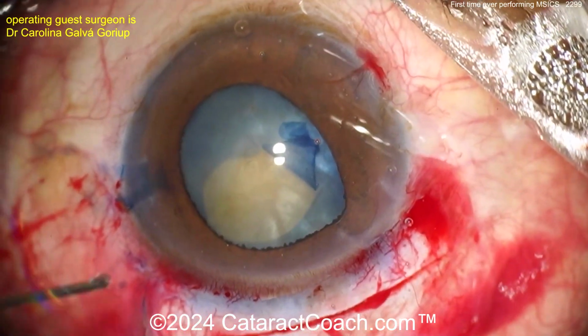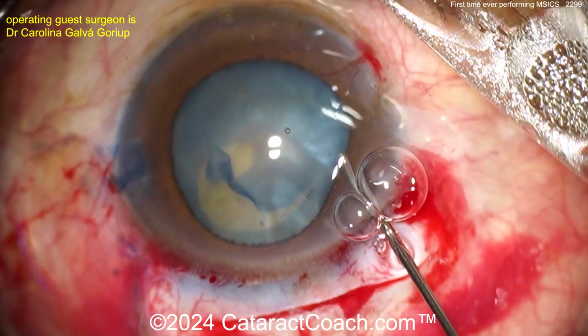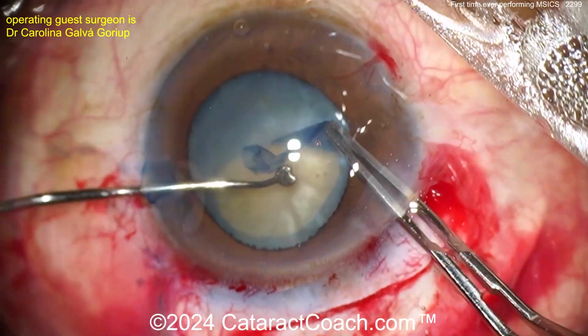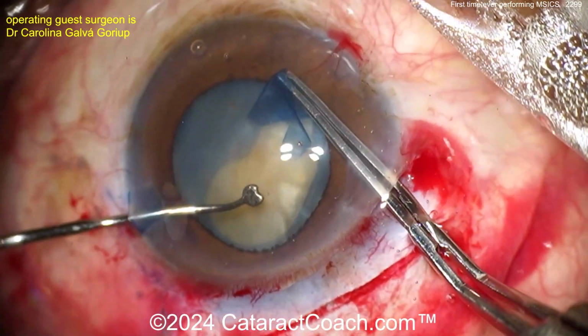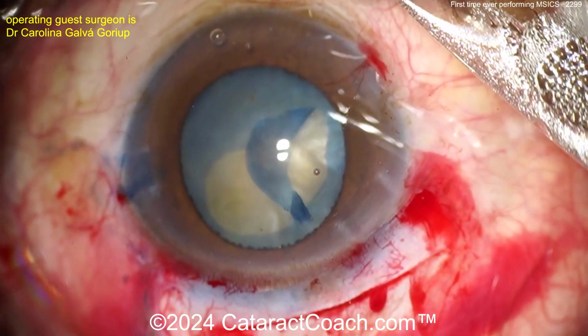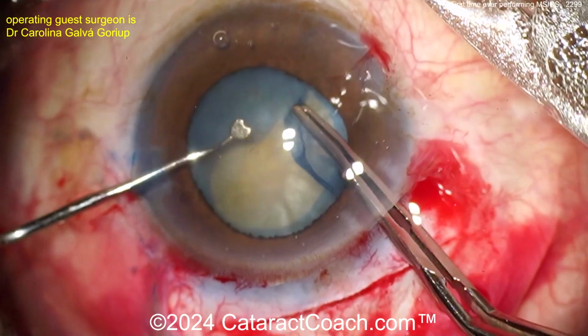If you do it this way, like our surgeon here in this video, it's actually easier because that's what you're used to. You're used to operating from that corneal, limbal angle. Whereas doing it from the scleral tunnel, it's a little bit different angle of approach, and sometimes it can be harder to do the rhexis. And so now, here you go, get more viscoelastic in. Get a juicy rhexis. Don't make a baby rhexis.